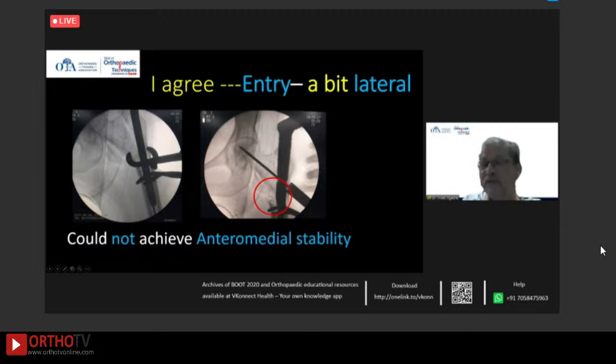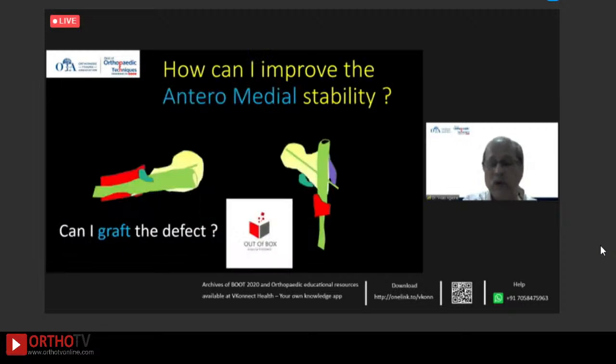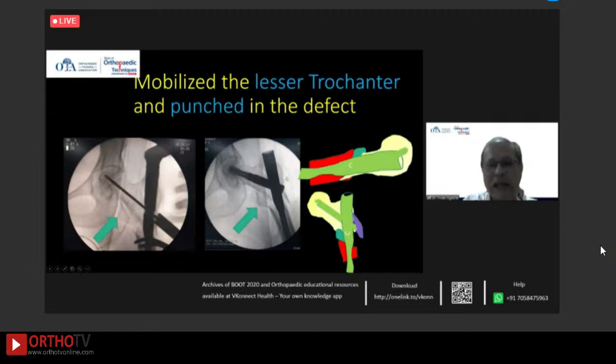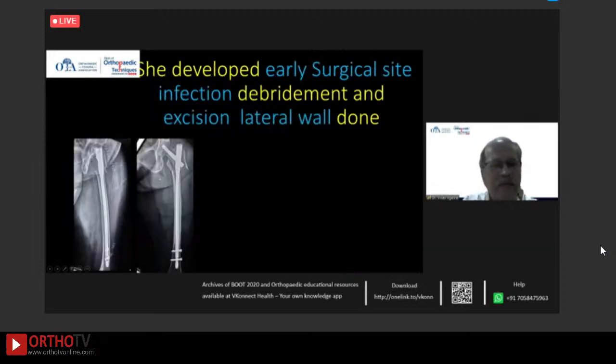Do I revise the entire fixation? Whether I'll be able to get a good stable fixation. So just an out-of-the-box thinking. Can I improve the anterior medial stability? Can I graft this defect? And then I suddenly realized that the graft is just there with me. I mobilized the lesser trochanter, just cut a few fibers of the iliopsoas tendon, mobilized the lesser trochanter and punched it in anteriorly and medially. Here you can see we have just punched it in, disregarded the lateral cortex, and you can see in the lateral view, punched in the lesser trochanter to get a good anterior medial stability.